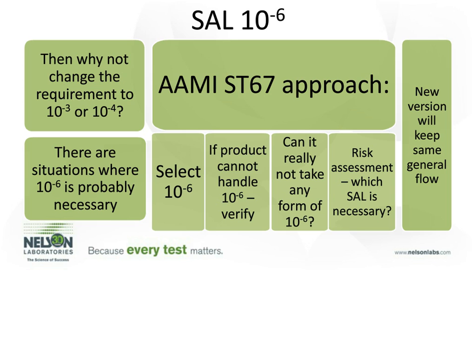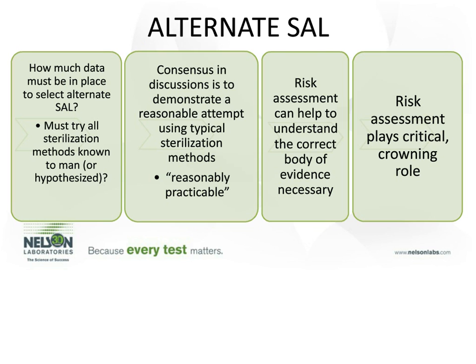Now, if it truly cannot take any form of 10 to the minus 6, then perform the risk assessment, which Wendy also mentioned, to help understand which SAL is really necessary for patient safety for that specific product and the use of that product. When addressing use of an alternate SAL, there are a few things to consider.